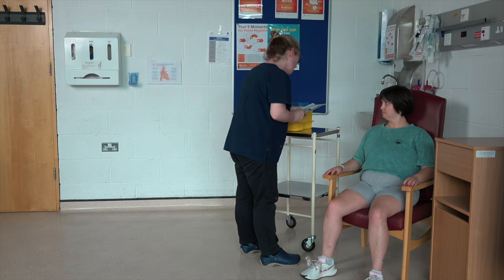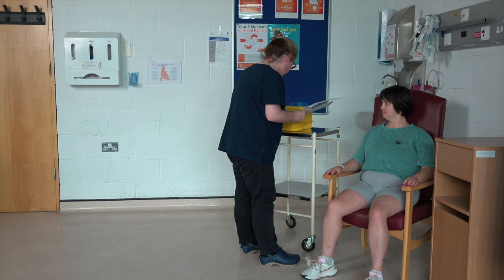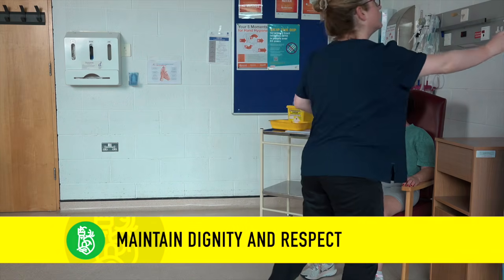Carry out hand hygiene. Risk assess for the necessity of wearing personal protective equipment. Maintain the patient's dignity and respect by closing the curtains for the procedure.